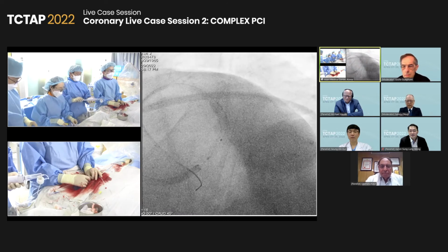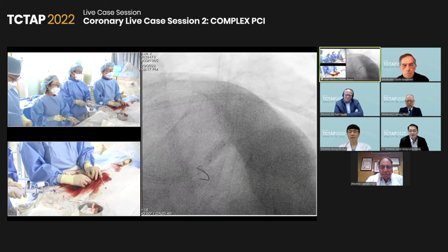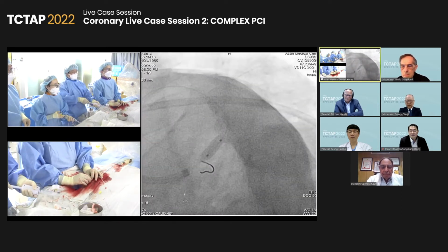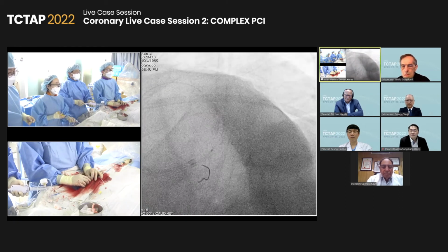Okay, nominal. 12. This is the 4.0 NC. 14, 16, 18. Deflation. Yeah, 20.